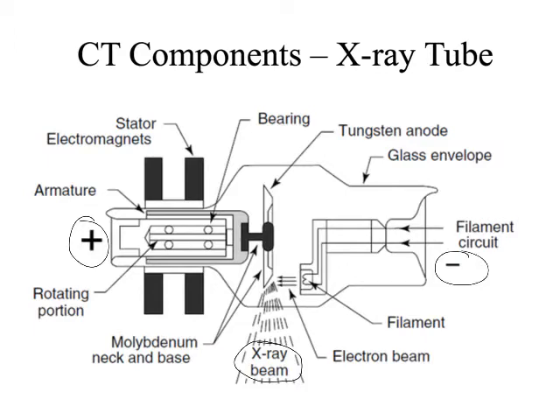If we were actually able to turn on that X-ray tube and see the X-rays that it's producing, guess what? We would probably all be unicorns, number one. But number two, it would be shooting out a bunch of rainbows, right? Because it's making a spectrum of energies. It's making a whole huge spectrum of energies over our unicorn population, right? That's a colorful metaphor that I like to think about a lot.